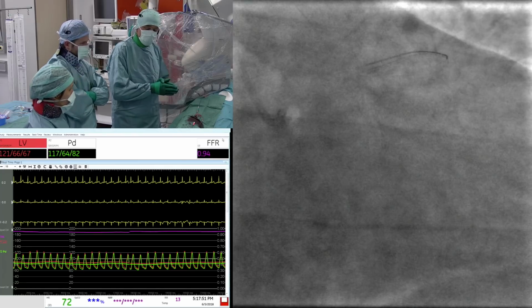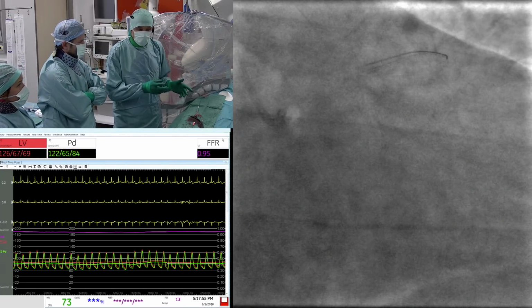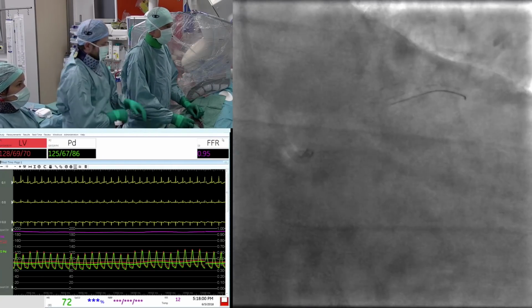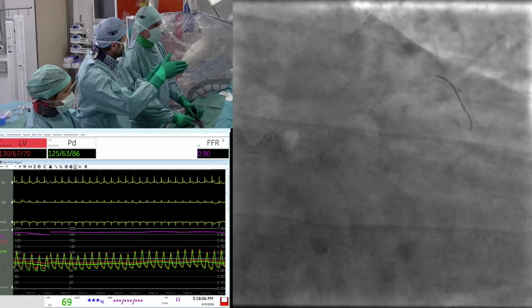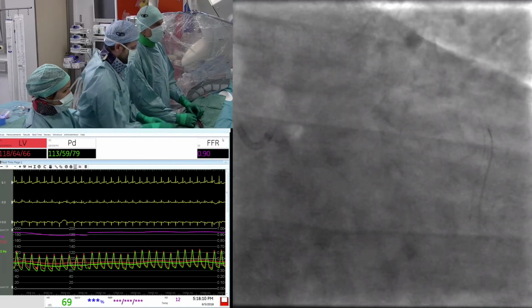We can do it in the aorta, but you can understand that going back in the aorta will complicate the case because we have to come back with the guiding in the ostium and so on and so forth. Okay, so actually what you mentioned is what should be avoided: your guiding is still in the aorta, but the wire is already in the left main, and there is an ostial lesion in between. Then equalization is not valid.